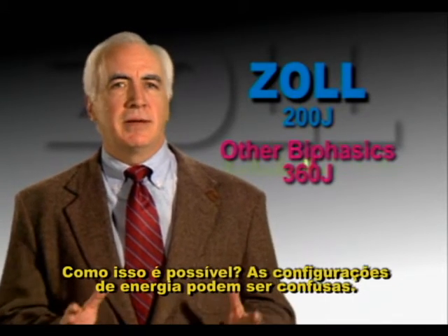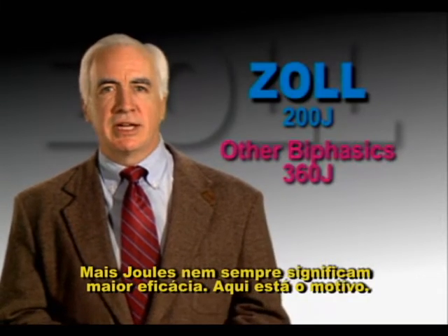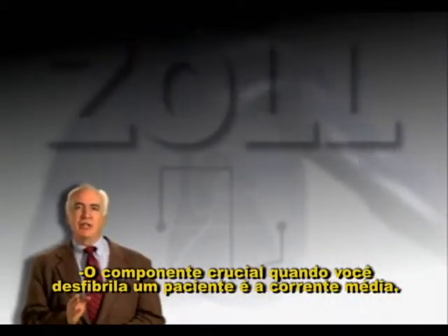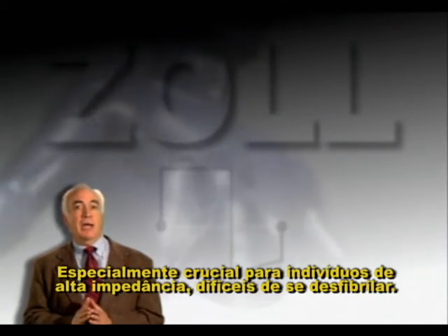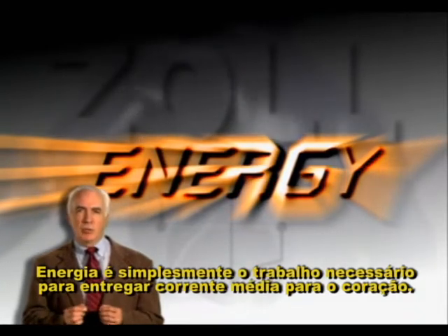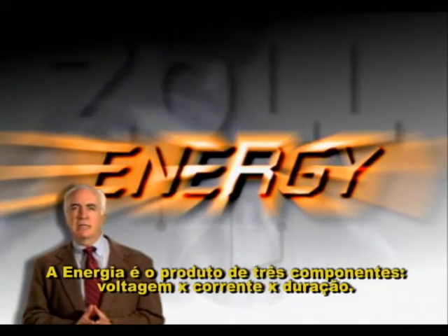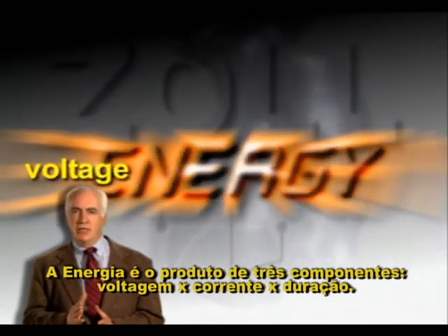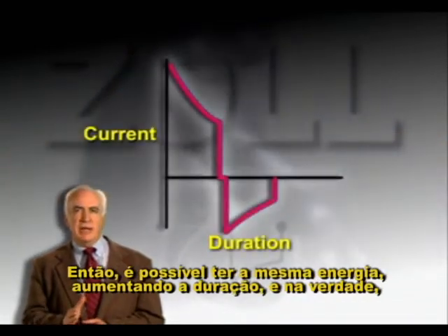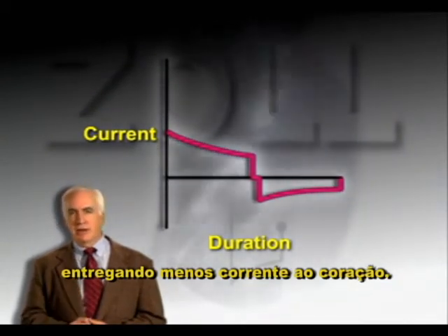Energy settings can be misleading. Higher joules don't necessarily translate into higher efficacy. Here's why. The crucial component when you defibrillate patients is average current, especially crucial for high impedance, hard to defibrillate individuals. Energy is simply the work required to deliver average current to the heart. Energy is the product of three components: voltage times current times duration. So it's possible to have the same energy just by increasing duration and actually deliver less current to the heart.